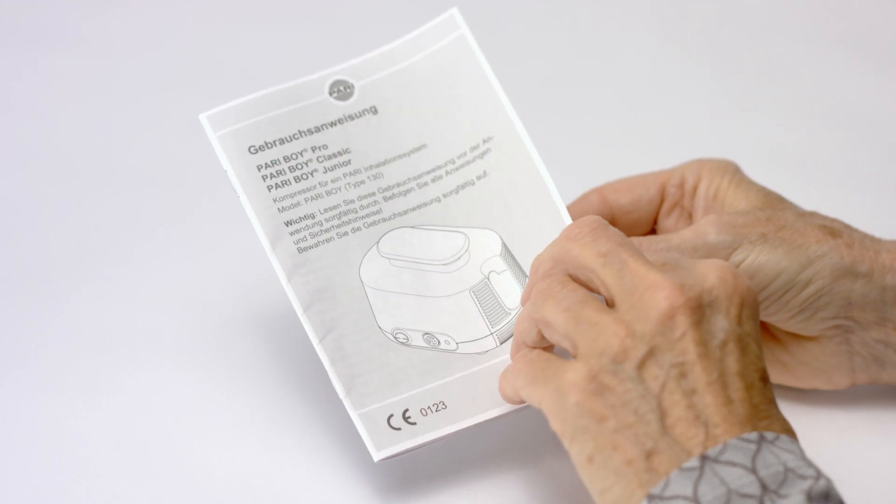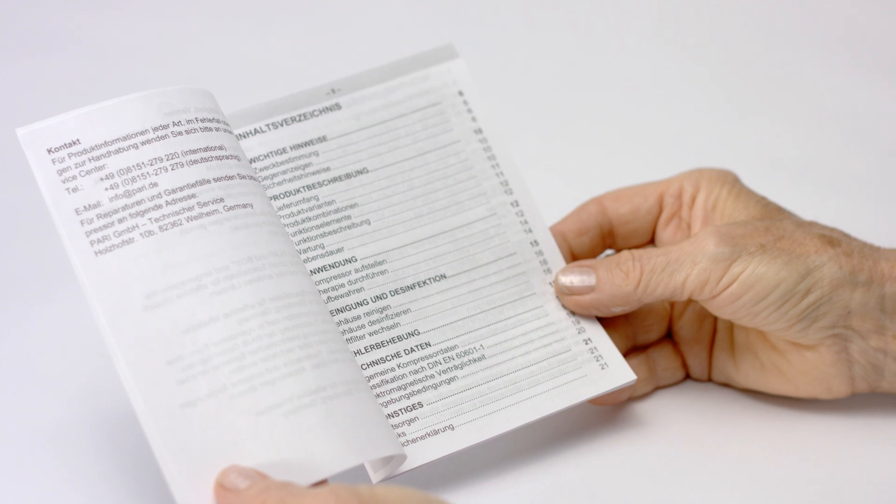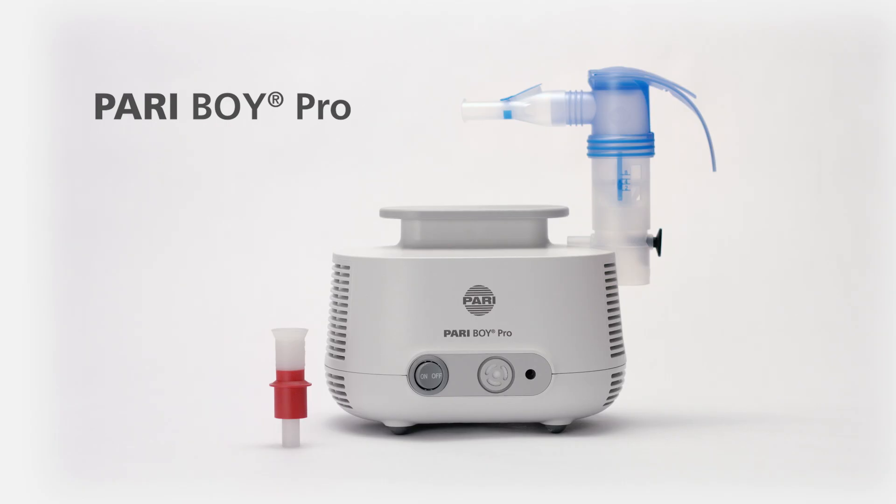Always refer to the instructions for use for details of how to use and clean your PARI nebulizer device. PARI BOY PRO.